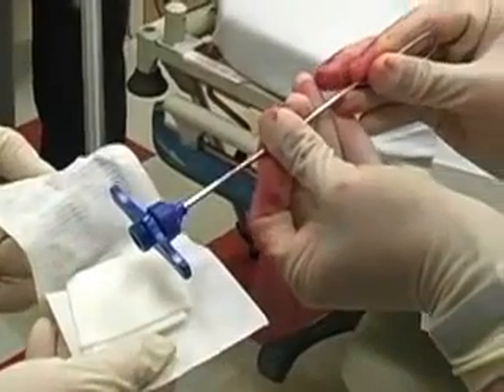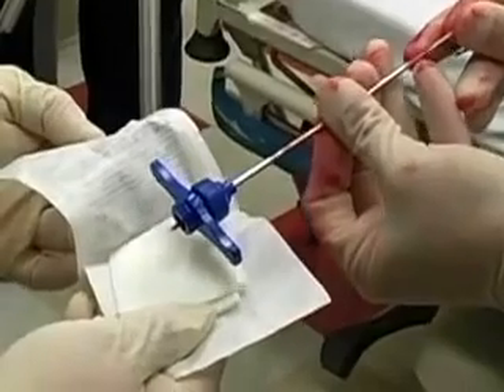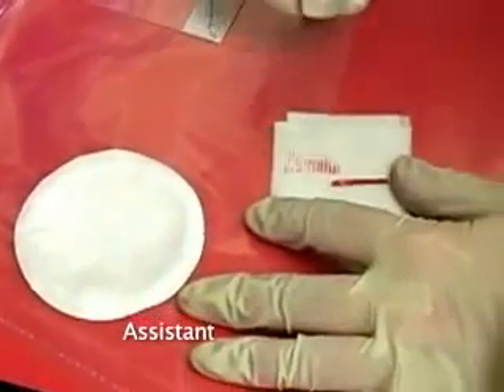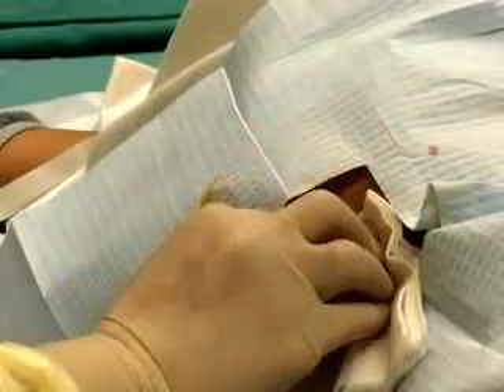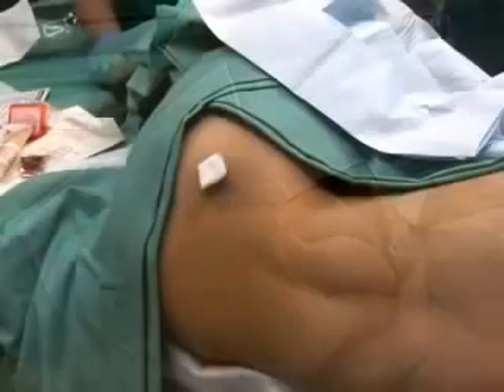Remove the specimen from the needle by inserting a sterile probe into the distal end of the needle and push the specimen through the hub onto sterile gauze or a slide. Inspect the specimen for adequacy of marrow.